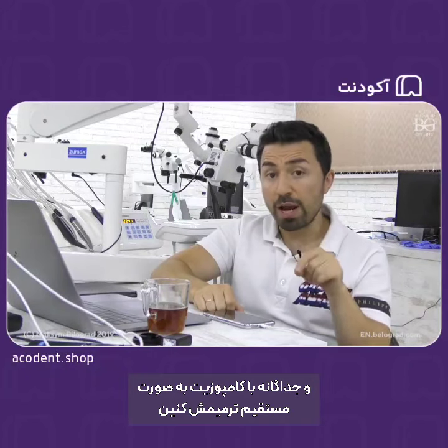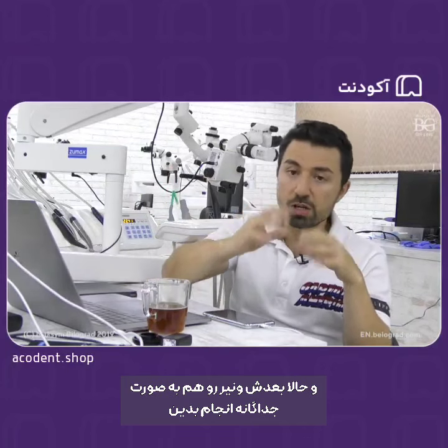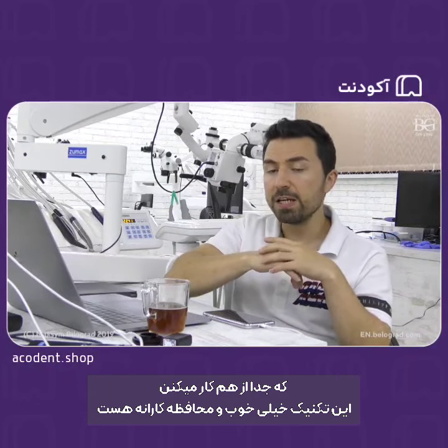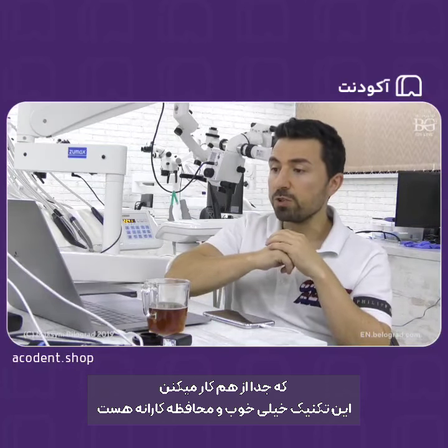Literally, you can do a direct composite restoration separately, and then you can do the veneer separately. So that will be a combined restoration within one tooth, and they will also work separately. It's a very nice, very conservative approach.